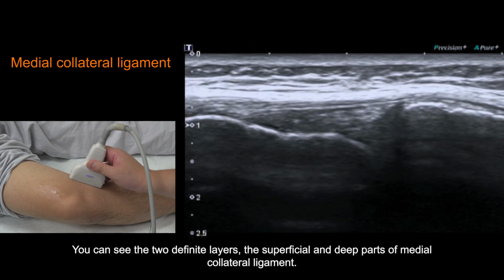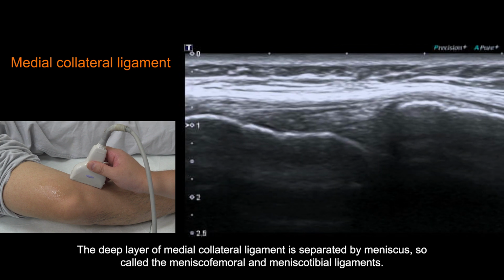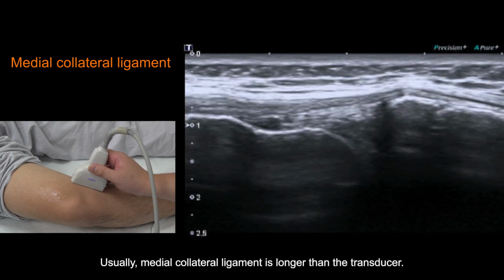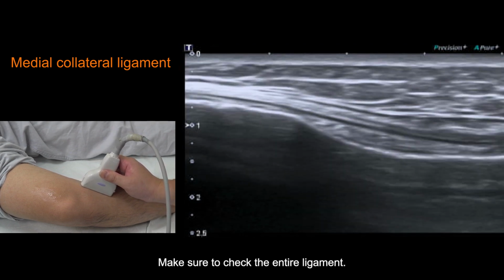You can see the two different layers, the superficial and deep parts of the medial collateral ligament. The deep layer of the medial collateral ligament is separated by the meniscus, forming the so-called meniscofemoral and meniscotibial ligaments. Usually, the medial collateral ligament is longer than the transducer. Make sure to check the entire ligament.